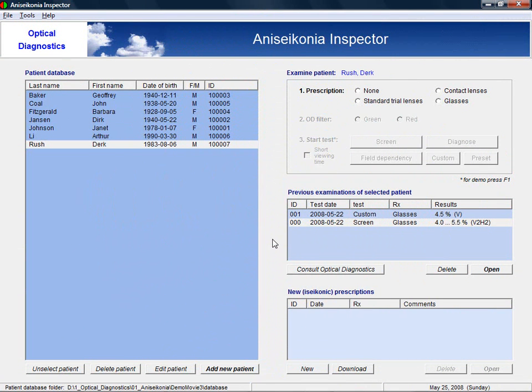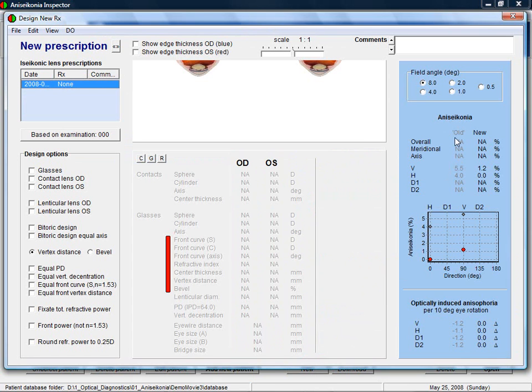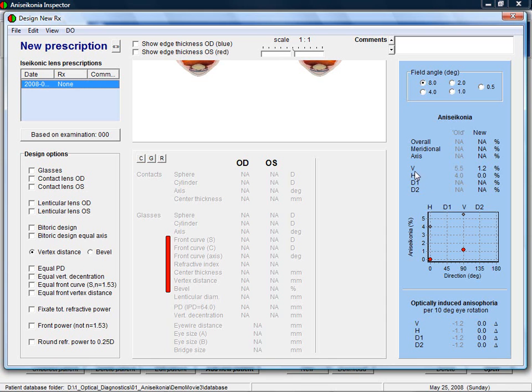To design a new prescription, you click on the New button. This brings us to the design window of the new prescription. On the right side, you find the results. For example, for the prescription that was used during the testing, here called the old prescription, we found aniseikonia values of 5.5% and 4% for the vertical and horizontal directions.